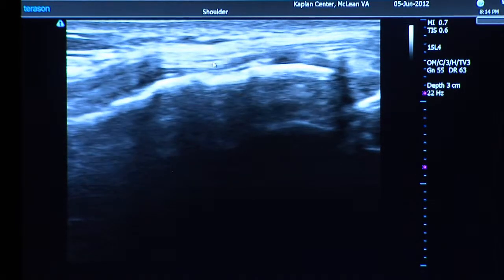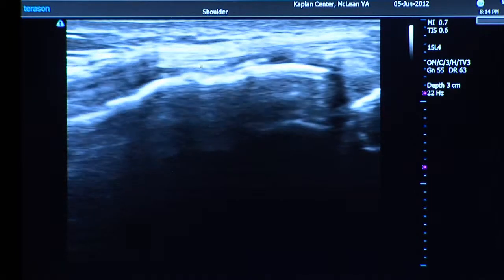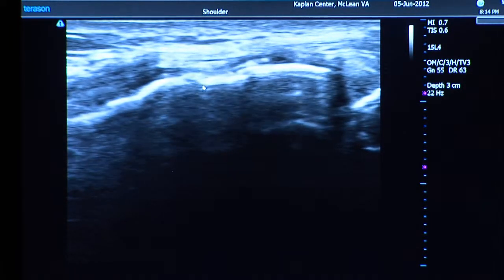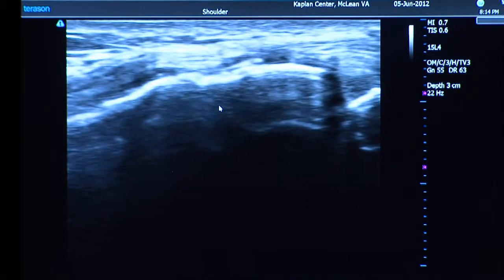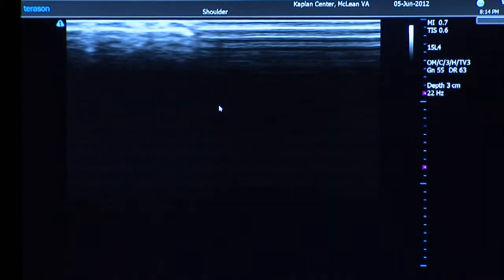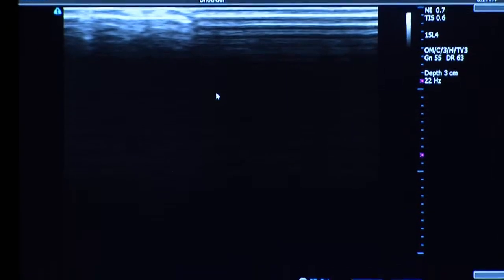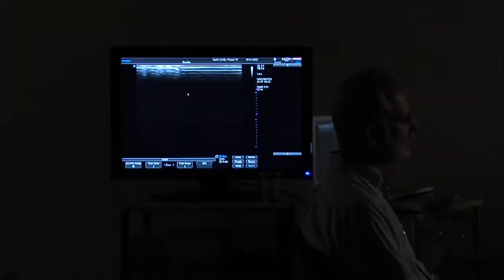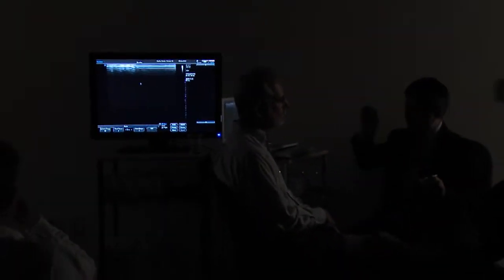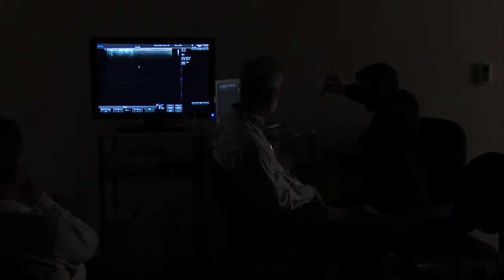With enough training it's not that difficult. If this were an area of injury — say a little tiny tear in the ligament — and I wanted to put PRP in there, I could place the PRP right in that little layer and inject about two-tenths of a CC to get that area healed. The degree of accuracy means you don't need to poke the needle around as much, you need less volume, and those two things combined make the procedure much less painful and very precise.